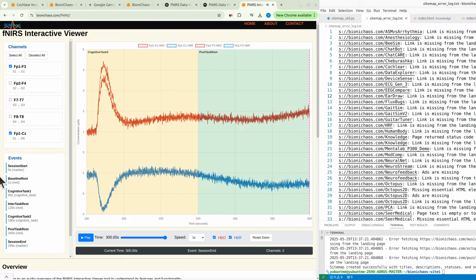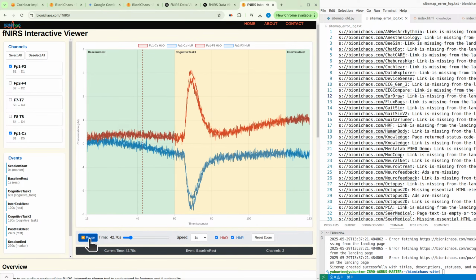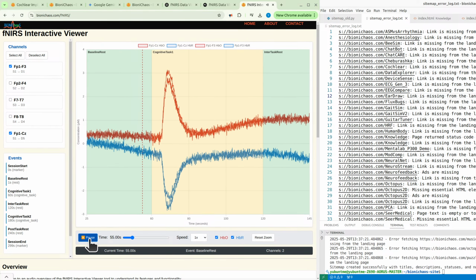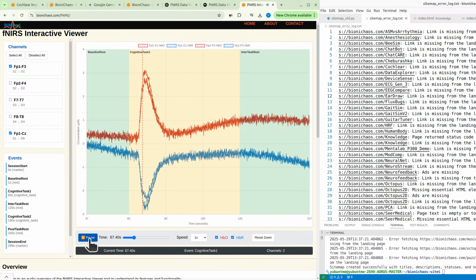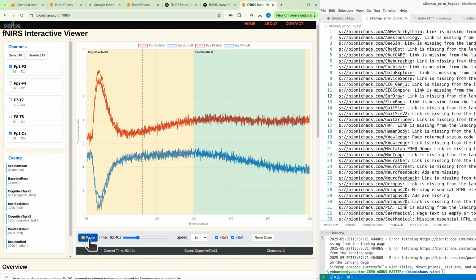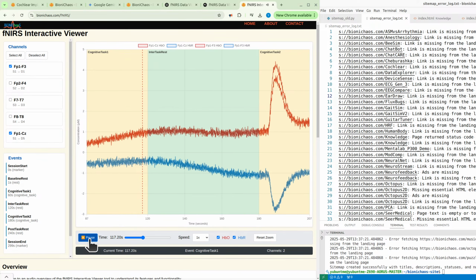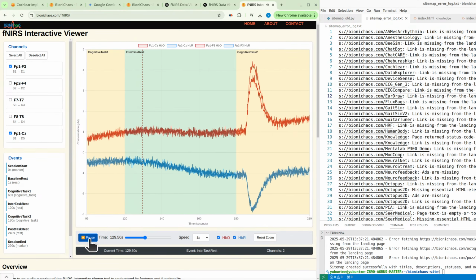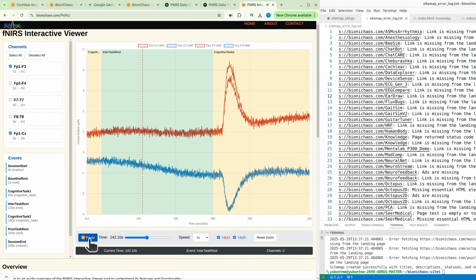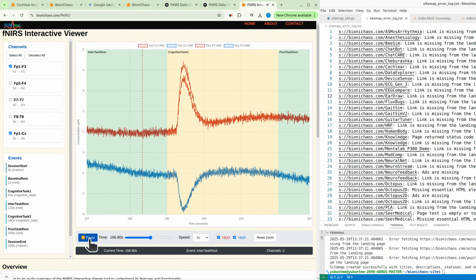Oh, absolutely. Real fNIRS data, especially from humans just doing tasks, is almost always much noisier. You'd expect artifacts from movement, heartbeat, breathing, maybe imperfect sensor contact, little jitters, spikes, maybe some channels just look bad. Right. This data looks, well, almost too clean. Like it's been heavily filtered, maybe even simulated. It just doesn't have that noisy texture you expect from raw or even typically pre-processed recordings. Okay, so more like simulated or heavily filtered data. Got it. What's red flag number 2?